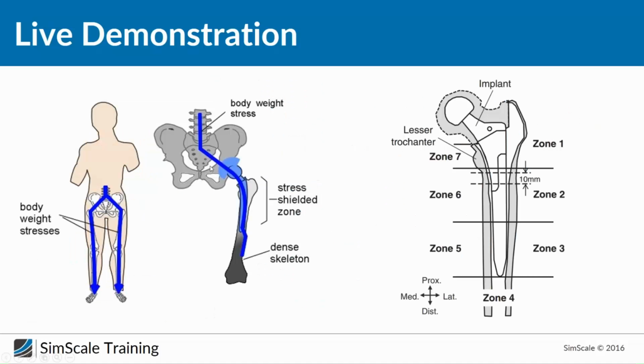And now let's imagine what happens when you become older, and for some reason, let's say you have a damaged femur head. Then it's necessary to replace this joint by an artificial joint with a hip joint prosthesis. The prostheses are generally looking like this.